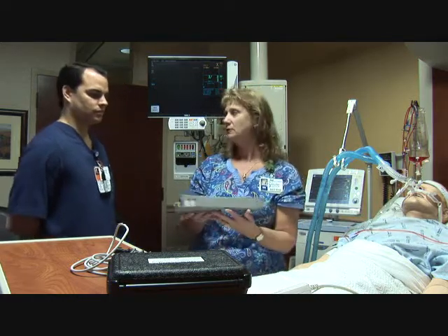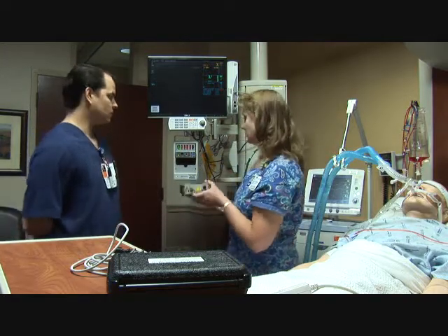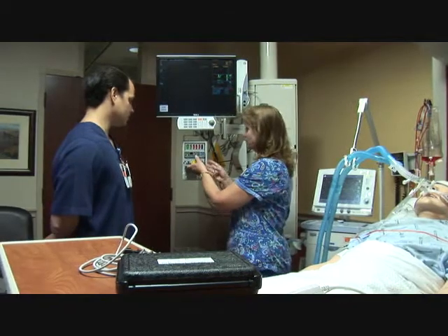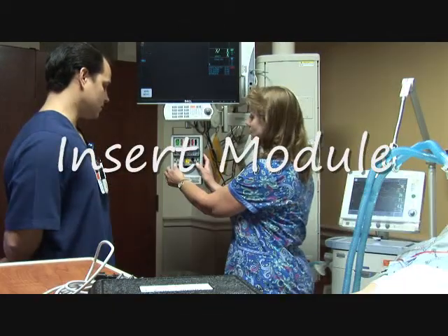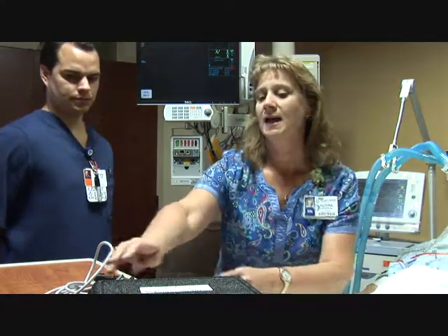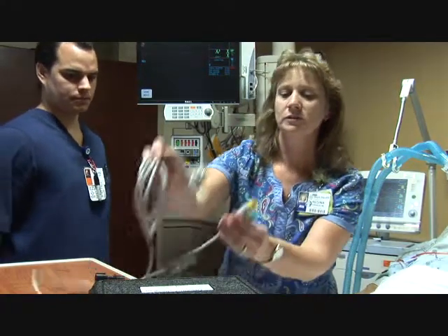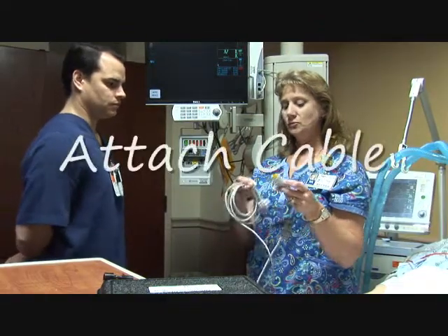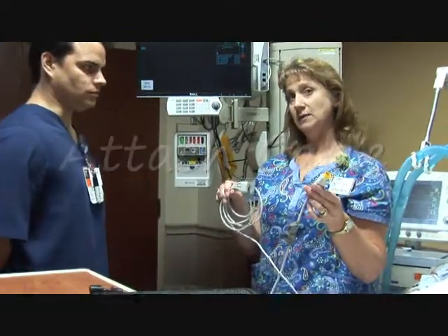So we're going to, Travis, first we're going to put the module into the track there, and you can hear it click. Okay, and then you get your cable, and you want to do yellow on yellow, and these are really expensive, so you want to really be careful.